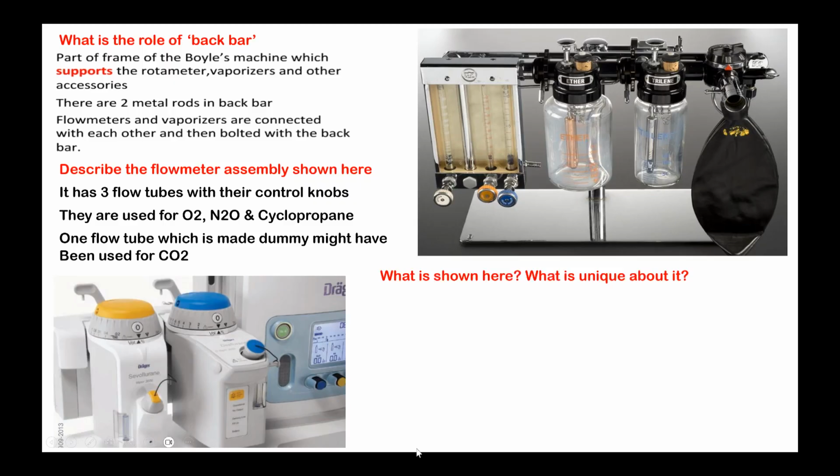Desflurane vaporizer. You have a desflurane vaporizer. What is this? Sevoflurane vaporizer. The name is also written here. Sevoflurane. So there are two vaporizers which are fitted here. And what is unique about it?